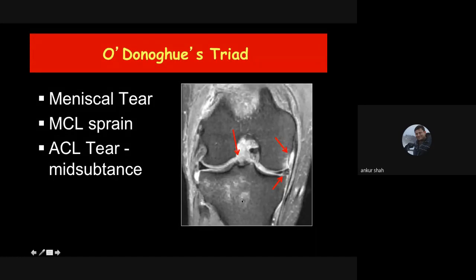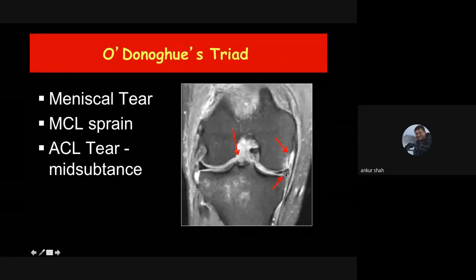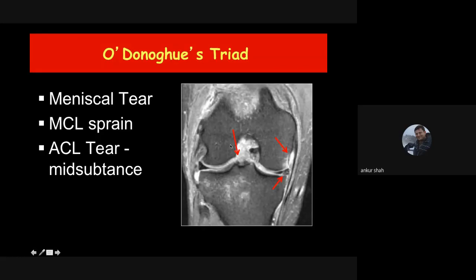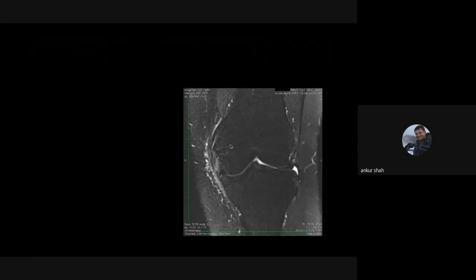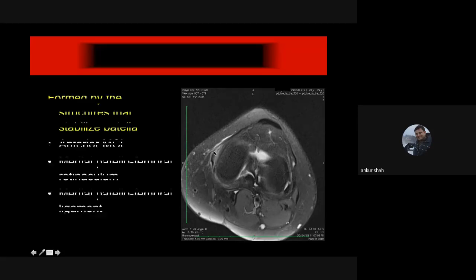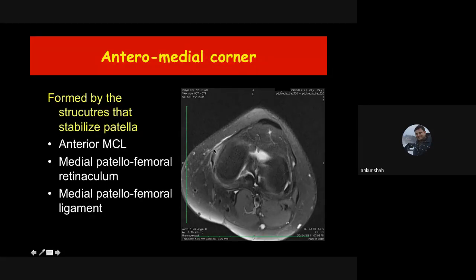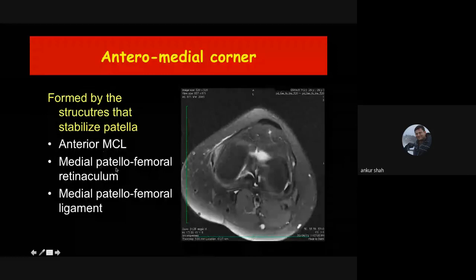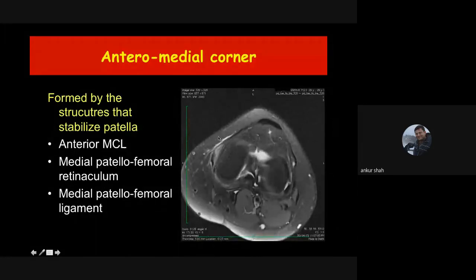An injury that looks like MCL injury may actually be anteromedial corner injury. On axial images, edema along the anterior MCL and the medial patellar retinaculum suggests anteromedial corner injury, which is formed by the anterior MCL, medial patellofemoral retinaculum, and medial patellofemoral ligament — structures that stabilize the patella. Do not misinterpret this as an MCL injury.